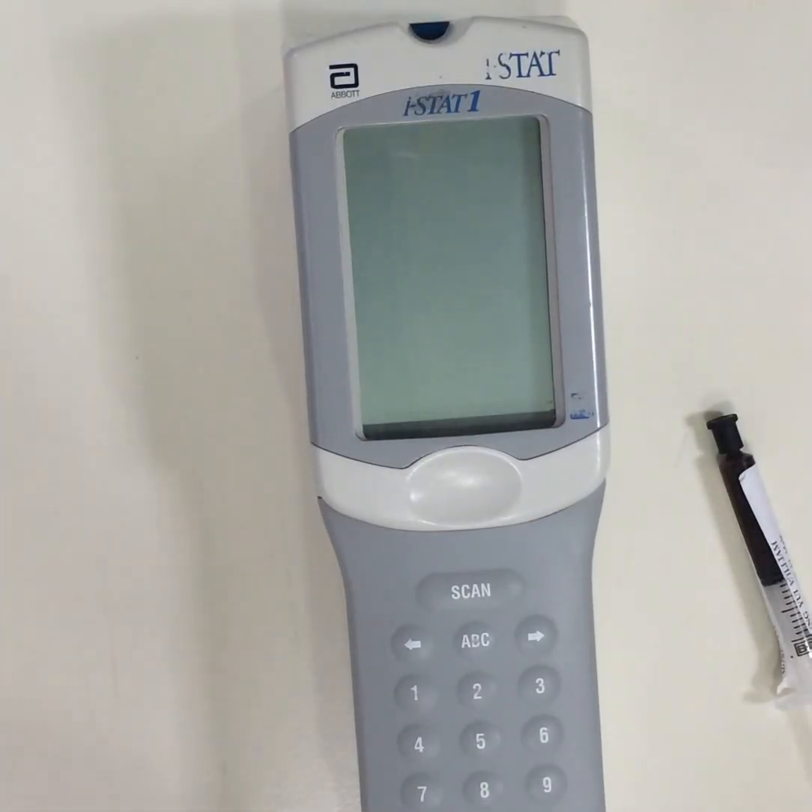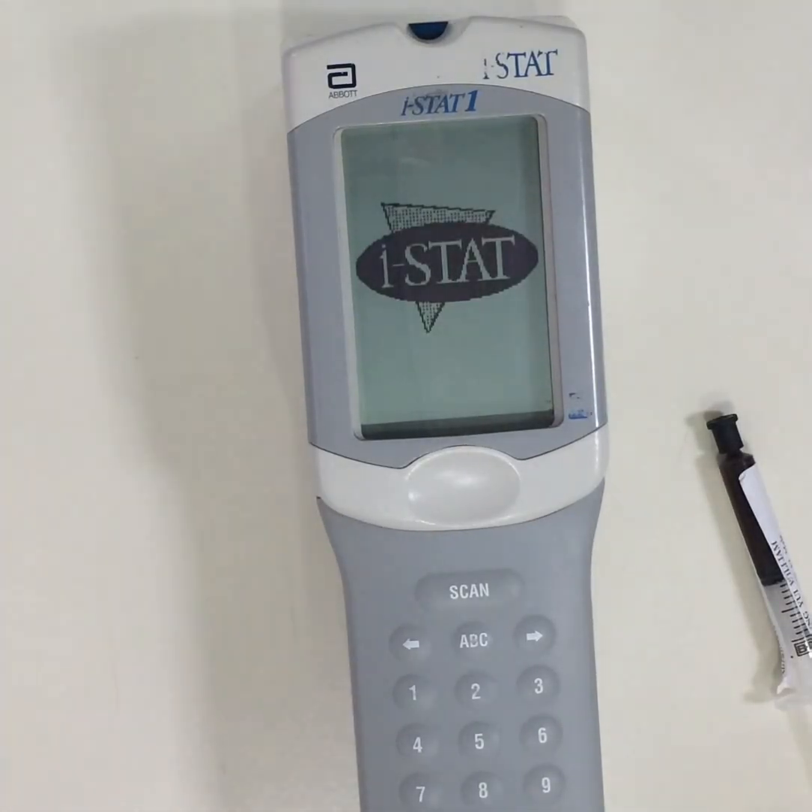This is an iSTAT Handheld Blood Analyzer by Abbott. It is used in integrated point-of-care testing.